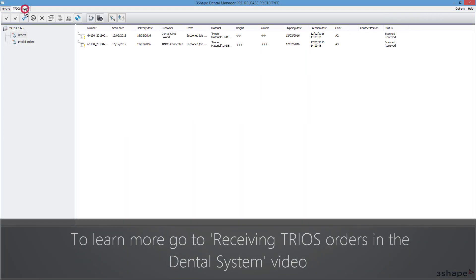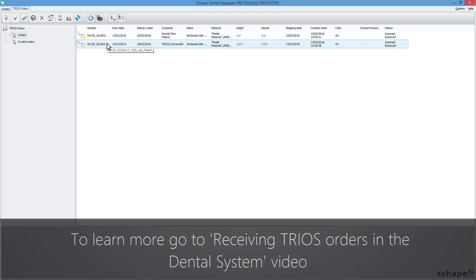The Trios Inbox is integrated in the Dental Manager application. Here you can manage all the orders, accept them or reject them. You can learn all the necessary details in the video titled Receiving Trios Orders in the Dental System.